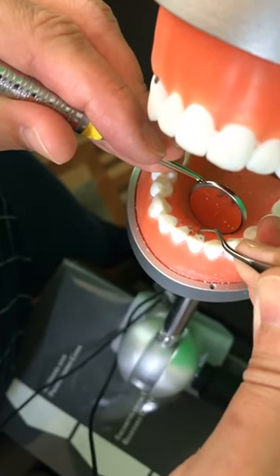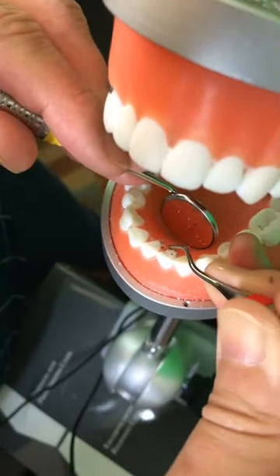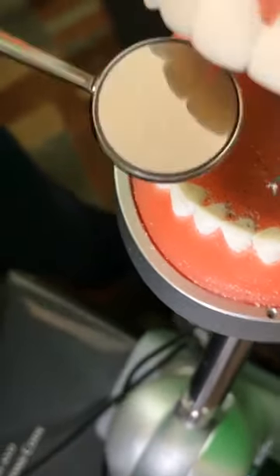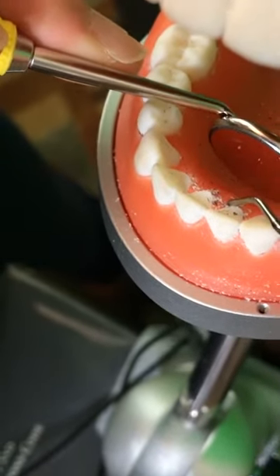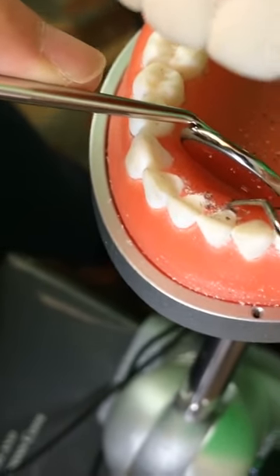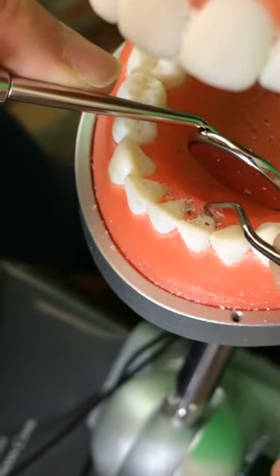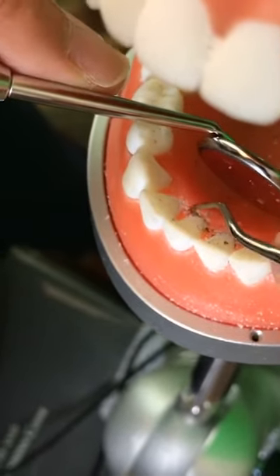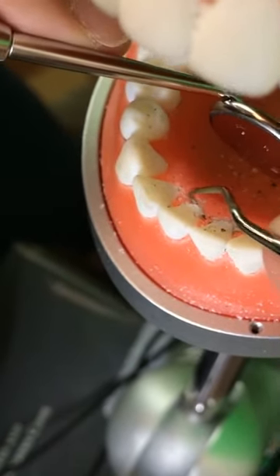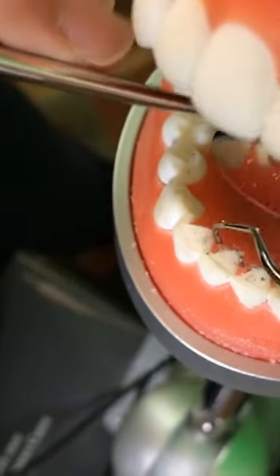Still on the lingual — surfaces towards from 8 o'clock. Now to get the concept: zoom in a little more so you can adapt the terminal shank for this surfaces-towards side. Remember, we are only walking two millimeters at a time. Every two millimeters of surface you should change your position. Two millimeters moved — surfaces towards, coming from 8 o'clock.